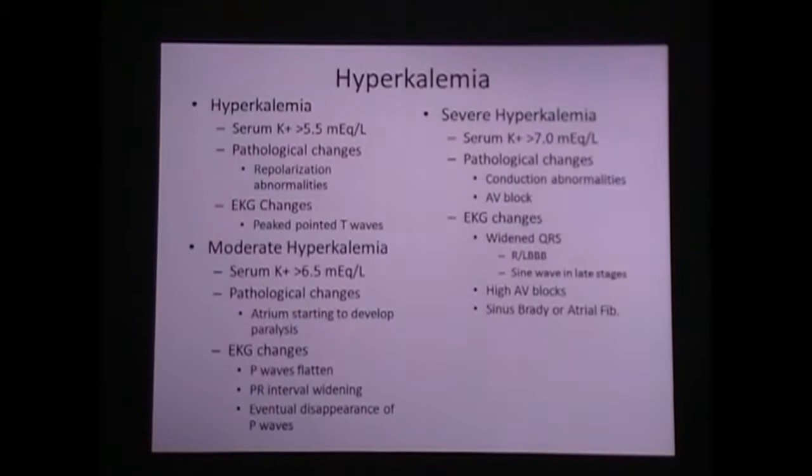You'll get a progressively widening QRS, right or left bundle branch, and the late stage of that is a sine wave, which I got some images of. You get high AV blocks, sinus brady, AFib.